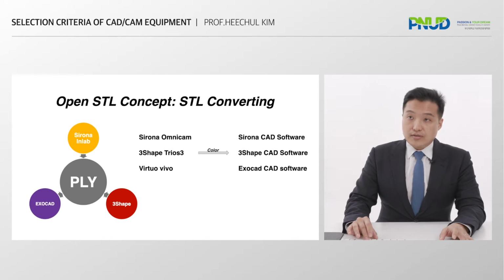Each intraoral scanner company mostly provides an STL converting feature. Any technician can design on any CAD software through a 3D file regardless of the type of intraoral scanner. So we no longer need to purchase and learn each different company's software.